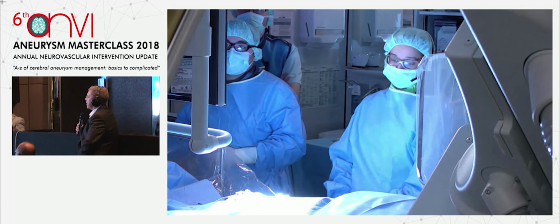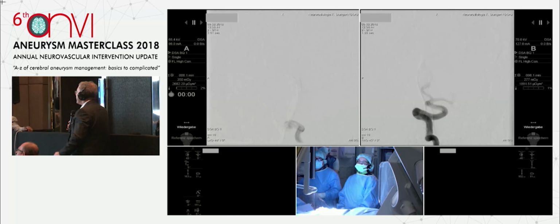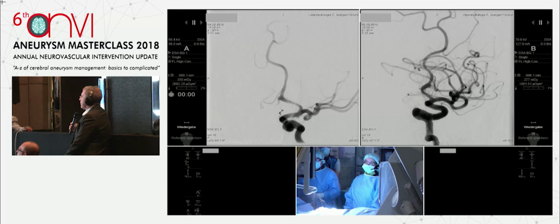Can we get the aneurysm picture? Aspirin and ticagrelor, okay. The aneurysm image. Okay, now we can. And if 3D is there, that will be terrific. Somehow we can see the 3D. Which is almost gone.